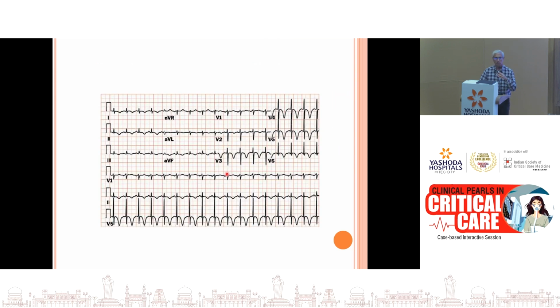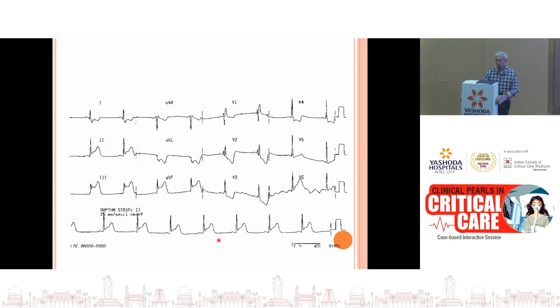This is an ECG that you often see in acute neurocare units. A patient who is recovering from a subarachnoid hemorrhage shows this kind of an ECG. You don't have to panic because this is very typical of a patient with raised intracranial tension due to a bleed. They can have these deep T wave inversions. In fact, it is known that patients who have intracranial bleeds have as much incidence of arrhythmias as patients who have an acute myocardial infarction, and this is because of the sympathetic surge that occurs because of the intracranial hypertension.